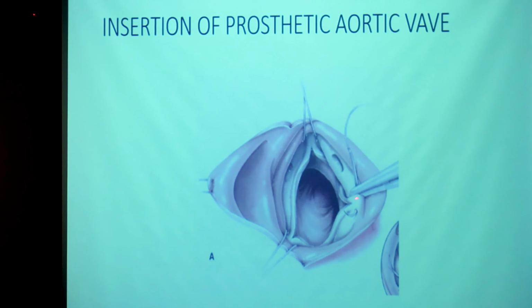And these are the modes of suturing. This is how sutures are used. A shows standard interrupted sutures with pledgets in the supra-annular position. C you use when you are trying to seat a valve in a small annulus. The figure of 8 sutures, used when the non-coronary cusp is injured, are not being used now, but you need to know about them.